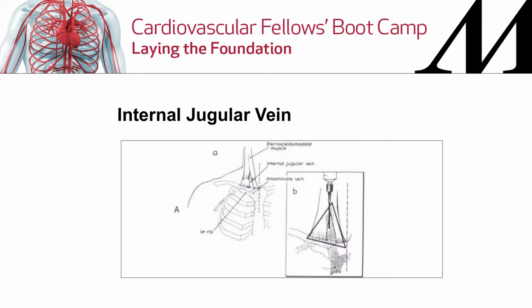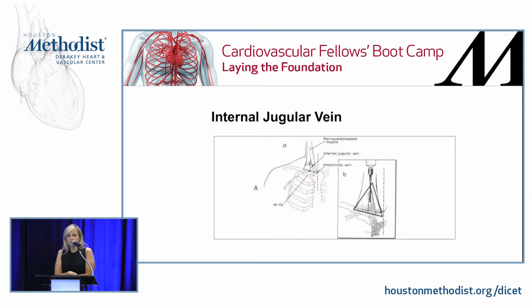So ultrasound should be the standard way to access a vein. Prior to routine access with ultrasound, we would access the jugular vein blindly using our landmarks, right? So the apex of this triangle that is created by the bellies of the heads of the muscle, you would access that. You would head always towards the ipsilateral nipple. This allows you to avoid the carotid artery.